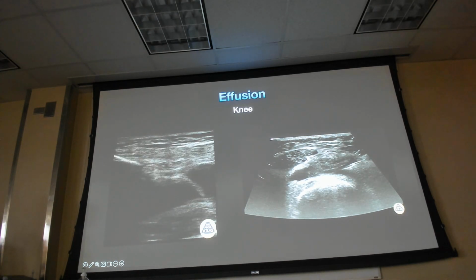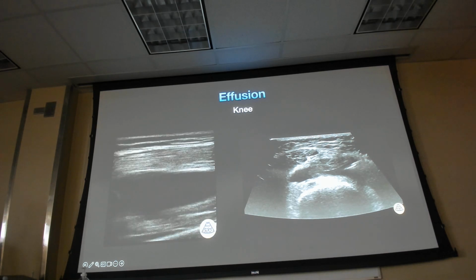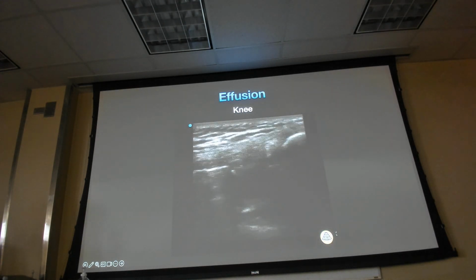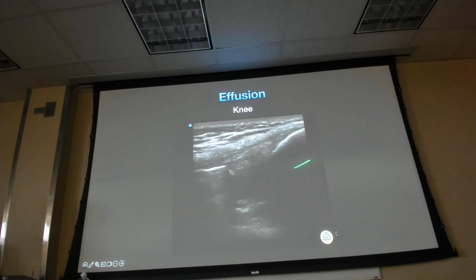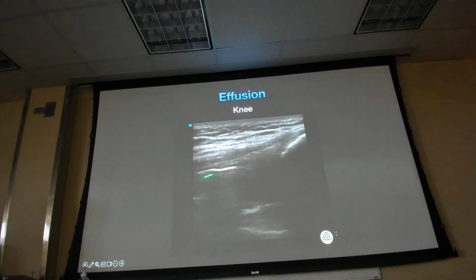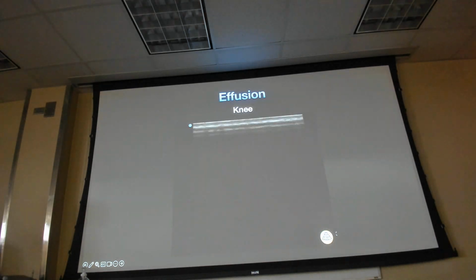But if you're working as an ortho PA, you might do a lot of these. It might be a lot more indicated than just the emergency department. What do y'all think here? Kind of hard to see, right? So what they're looking at is an effusion, but they actually see that this white bone is disrupted. You got white bone, nothing, then white bone, so there's actually a patellar fracture.